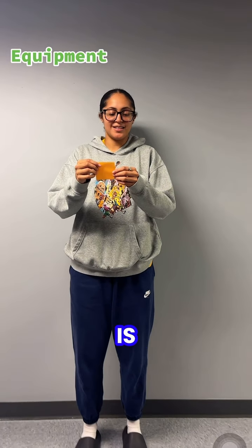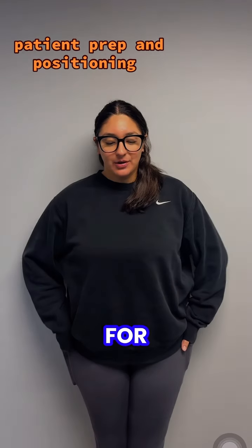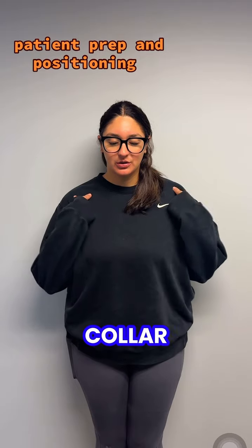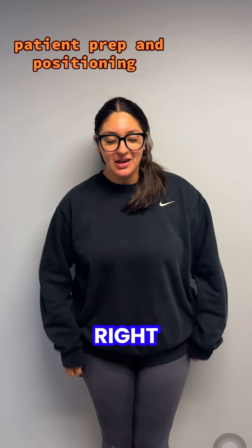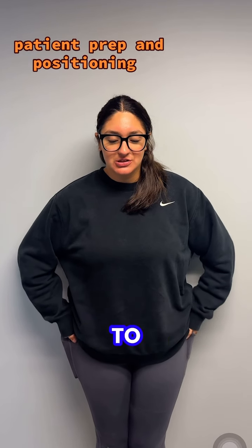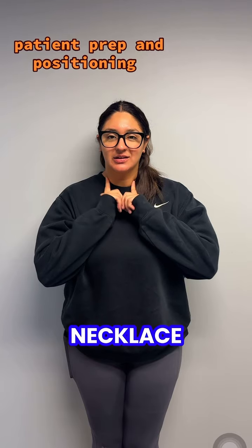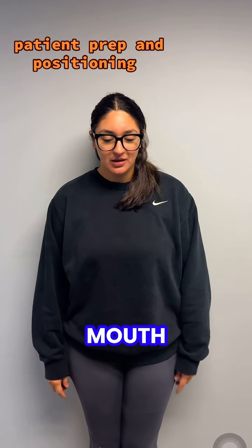The equipment used is an X-ray tube head, a head positioner, and exposure controls. For patient preparation, you would need a lead apron with no collar, because collars will give you a white line, right? You want the patient to remove any jewelry, appliances, earrings, necklace, nose piercings, glasses, dentures, anything that's in the mouth.